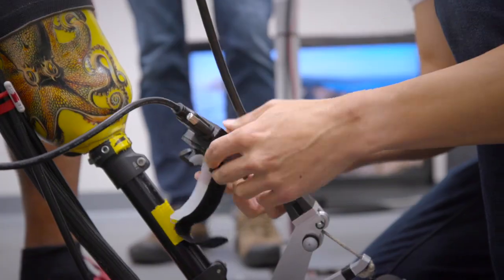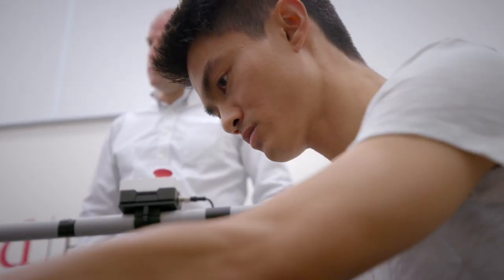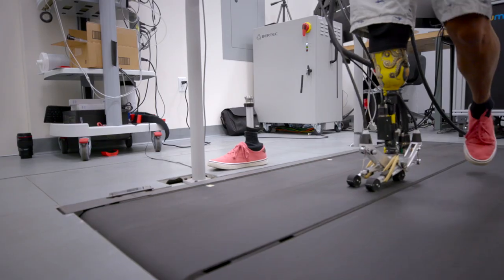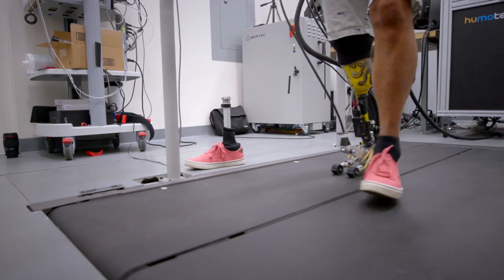We have it connected to really powerful computers and all sorts of sensors to ensure that we never run out of signals. These are robotic prosthetic devices that can sense the person's movement and the environment, and then take corrective actions to help improve their balance or propel them forward and make walking easier. We're using these as design tools so people can have the physical experience of interacting with a new device without having to build it.